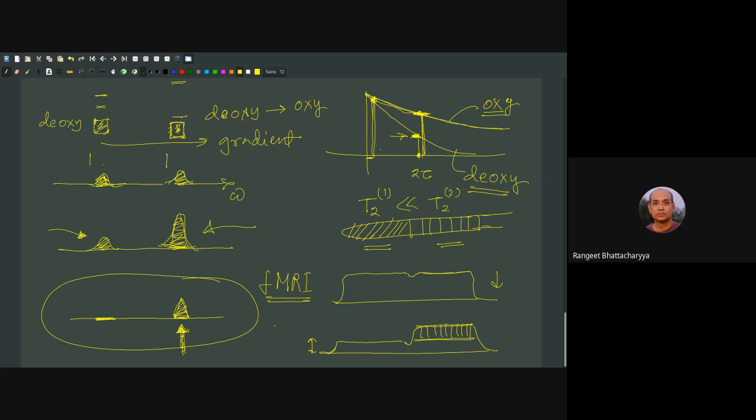The only downside is MRI takes a bit of time. Some people say they are uncomfortable. Some people feel claustrophobic going inside a narrow chamber, which is not a nice feeling. Those are the disadvantages. But otherwise, if we disregard those disadvantages, as a method it's quite robust. It works very well. It's well studied and known for a while now. So this is what I wanted to share. I'm kind of done.